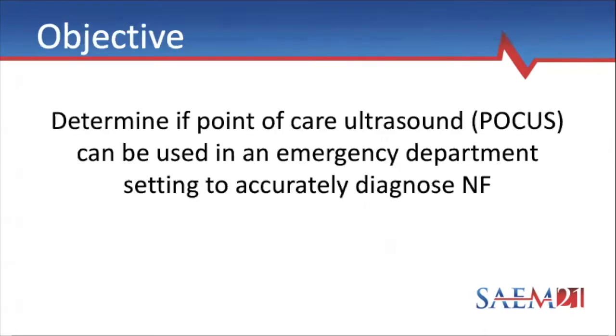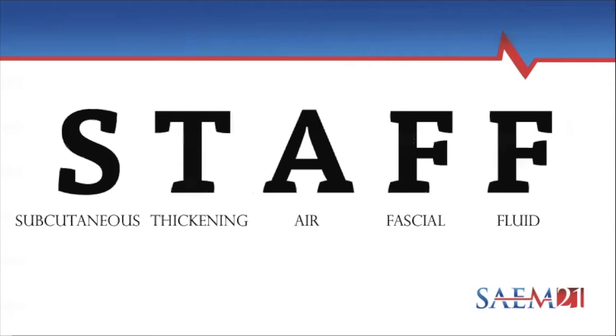So our objective with this study is to determine if point-of-care ultrasound can be used in an emergency department setting to accurately diagnose or aid in the diagnosis of necrotizing fasciitis. In order to diagnose necrotizing fasciitis from an ultrasound clip, our ultrasound fellowship trained physicians use the STAFF exam. STAFF stands for subcutaneous thickening, air, and fascial fluid, which is what the physician looks for in the ultrasound of the infected area.